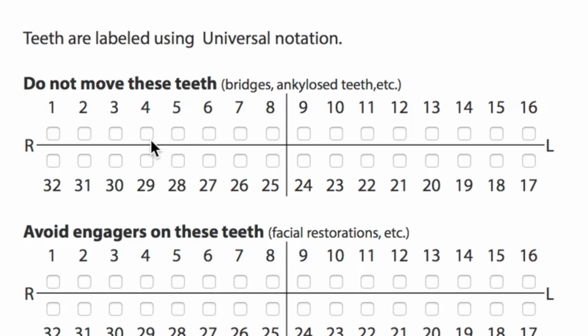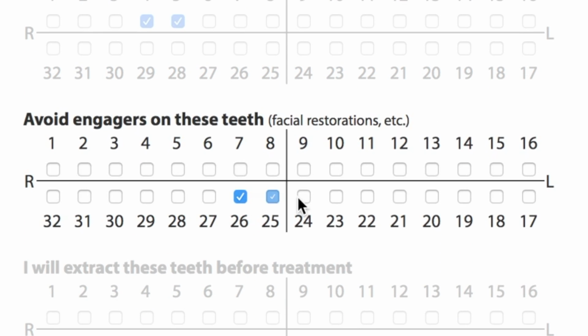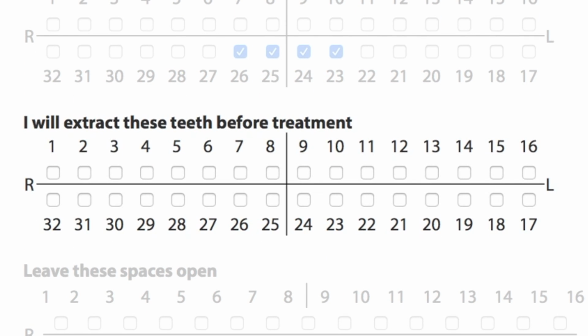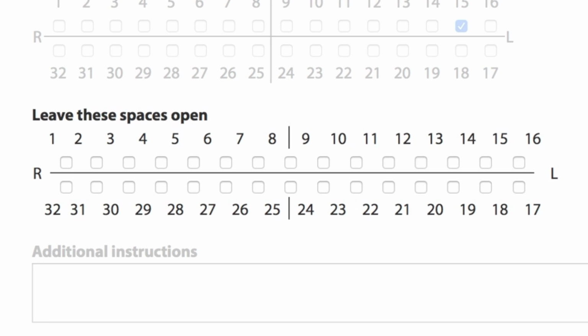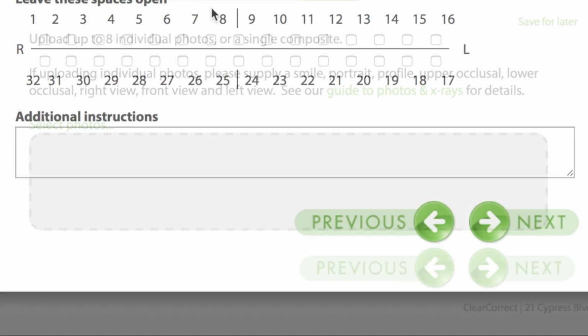In the next section, you can provide additional instructions. Indicate any teeth that should not be moved, such as bridges or ankylosed teeth. You can also tell us to avoid placing engagers on certain teeth. If you plan to extract teeth before treatment, let us know so we can remove them from our model. If you want to end the treatment with open space between some of the teeth, let us know here. You can also provide freeform instructions at the bottom of the page. Again, the more detailed, the better.